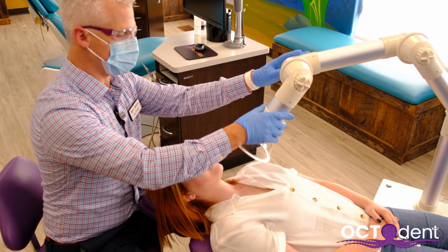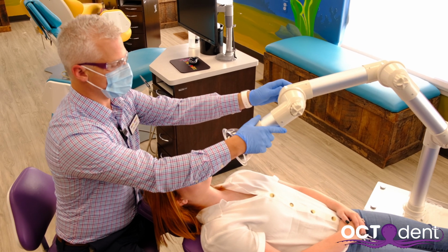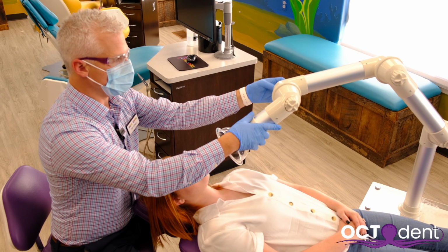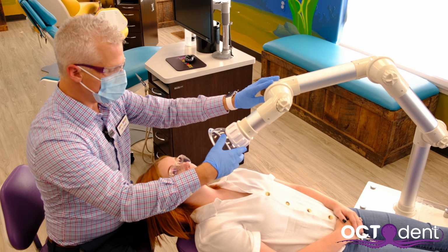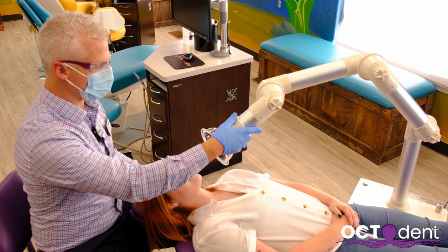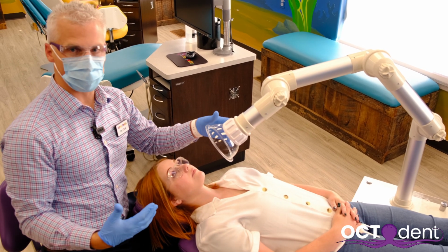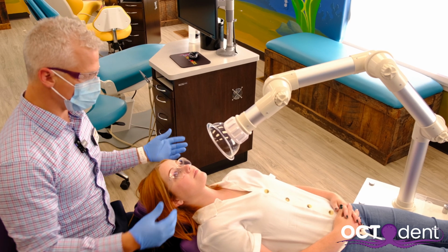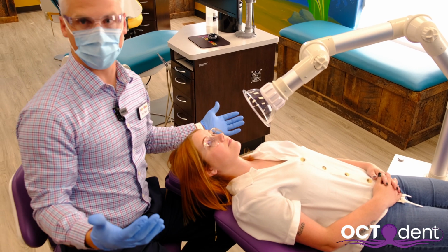Now, as far as the distance for an operative or a four-handed procedure, if you notice, I just position this a little bit differently, okay? You can also position the patient a little bit differently. It just depends on how you want to do it. But this right here would be a comfortable distance where I might typically work whenever I have four-handed dentistry. As you can notice, this is plenty of distance. It really doesn't get in my way.